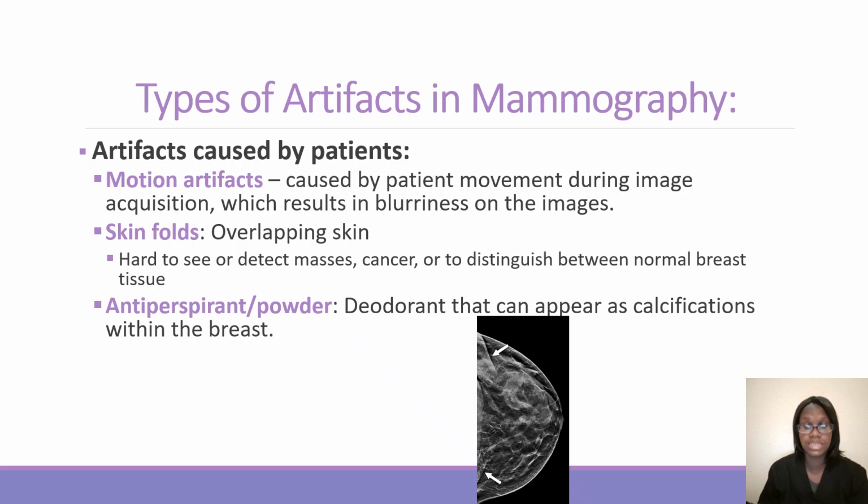And then if a patient does get called back, now they're going to be worried that a cancer was seen, or worst case scenario, they have to get a biopsy and pay extra money for a biopsy when it was just deodorant specks under their arm.